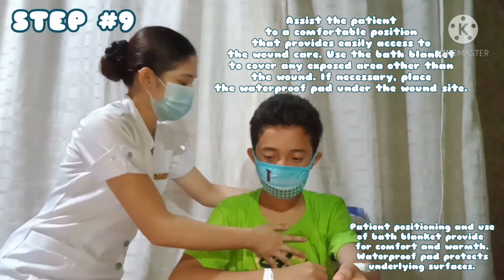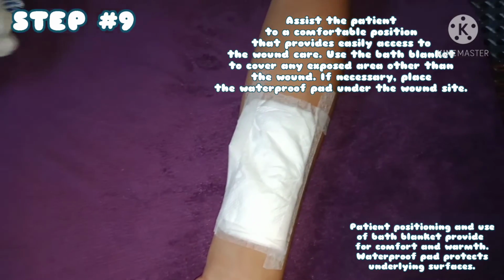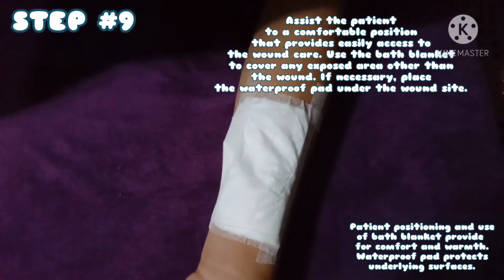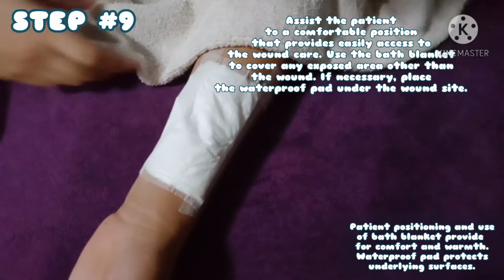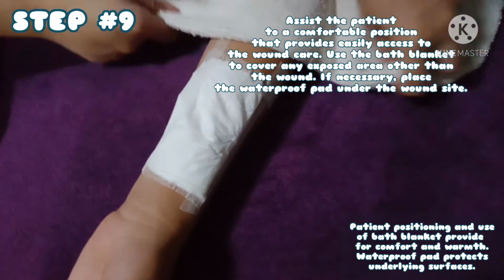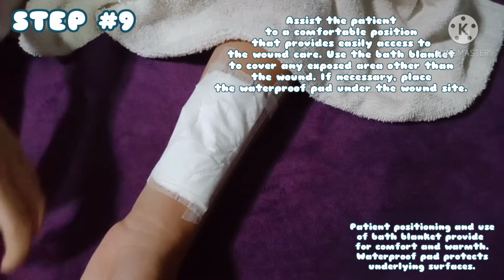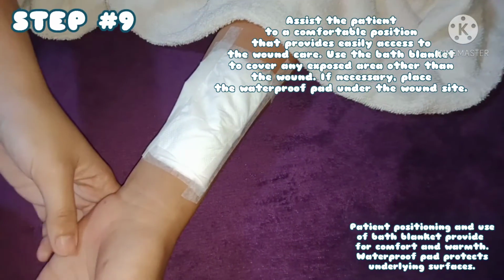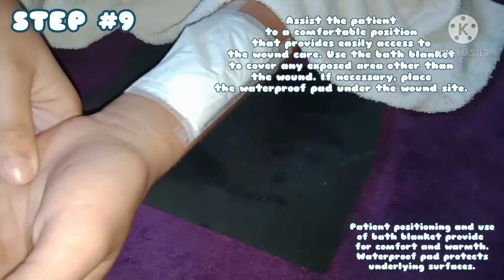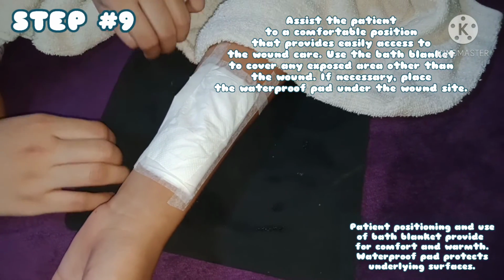Step number 9. Assist the patient in a comfortable position that provides easy access to the wound area. Use the bath blanket to cover any exposed area other than the wound. If necessary, place the waterproof pad under the wound site. Patient positioning and use of a bath blanket provide for comfort and warmth. Waterproof pad protects underlying surfaces.